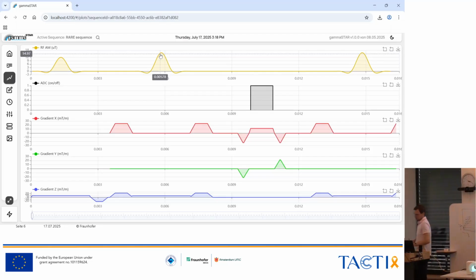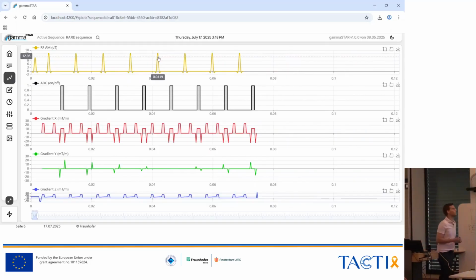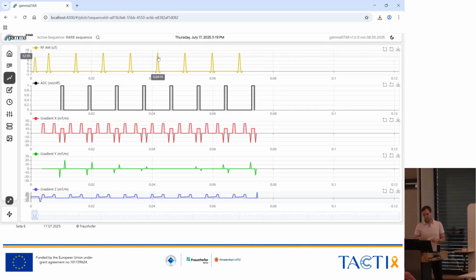That's a simple spin echo acquisition, but we can go a bit further and do that over and over again, so that we have our excitation and refocusing, we get an echo here, and that signal will get refocused and read out again and again and again. With that, with a single excitation, we can read out multiple lines. We excite once, and then, depending on which lines we choose, can read out 1, 2, 3, 4, 5 lines.